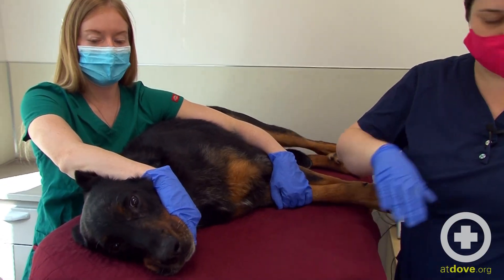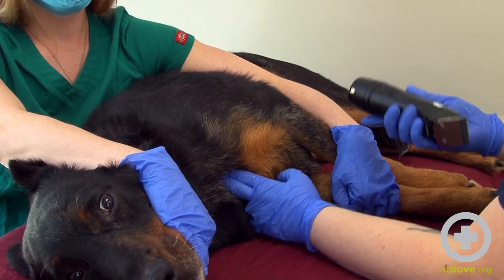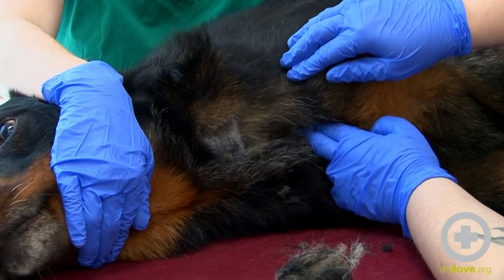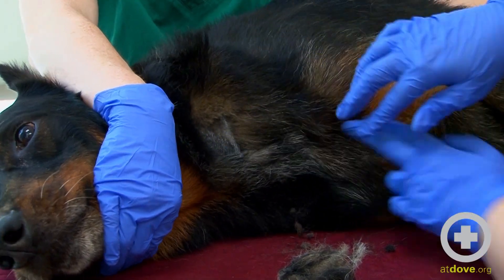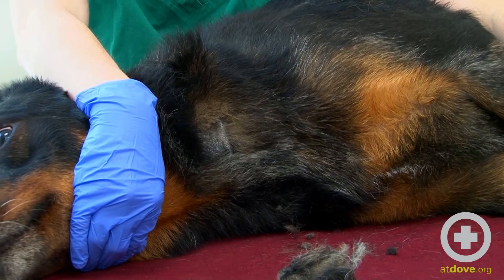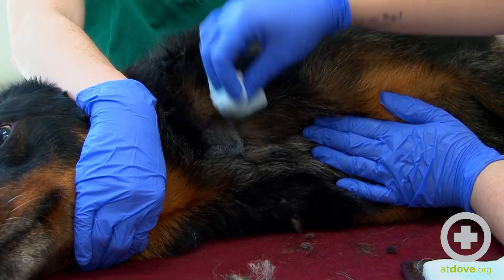I am going to use clippers to shave his jugular area. I'm going to hold down here and then palpate his jugular vein, kind of spread the hair out. Then I'm going to use a chlorohex and alcohol combination to scrub the area, just getting some of this hair out of the way.